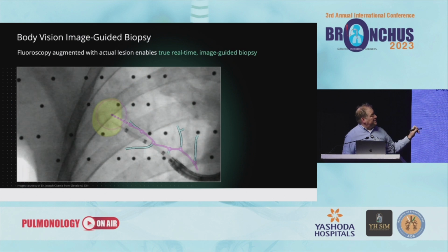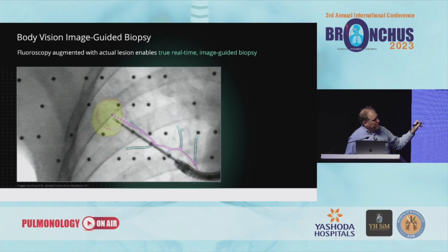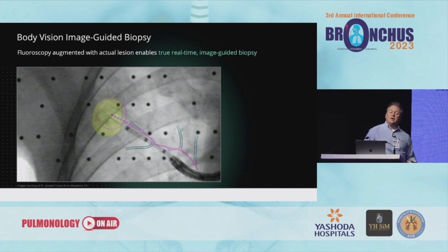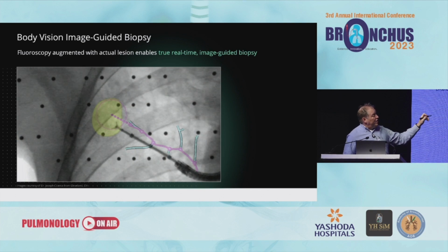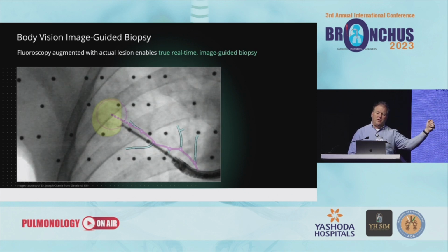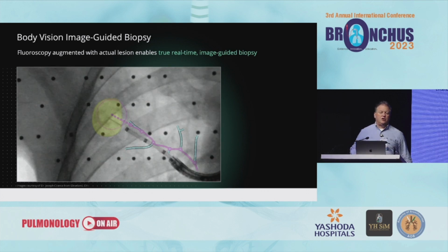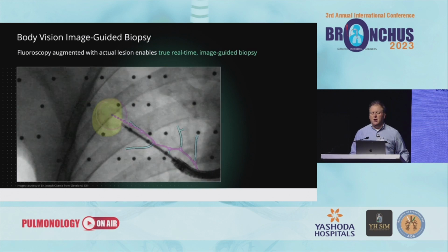And then while you're taking your biopsies, again, you can now, in this particular image, you can see the lesion is actually fluoroscopically visible. There's a gray ball behind it, but many times, of course, it's not. This yellow ball, though, is the lesion. You marked it. So as you pass whatever instrumentation into it, you know you're there. And you say, well, how do I know I'm not anterior or posterior? Rotate your C-arm 45 degrees one way, take a shot, rotate it 45 the other way, take a shot, and see across two orthogonal planes that you are still inside the lesion.